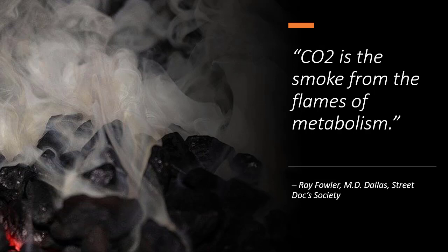So when you understand that, you understand that End-Tidal CO2 is more than just confirming tube placement. It's more than just looking at it and saying, okay, yeah, my albuterol, Atrovent, or DuoNeb, or Xopenex neb worked. It is so much more, and when you understand that, then you're beginning to get into what End-Tidal CO2 can do for us.